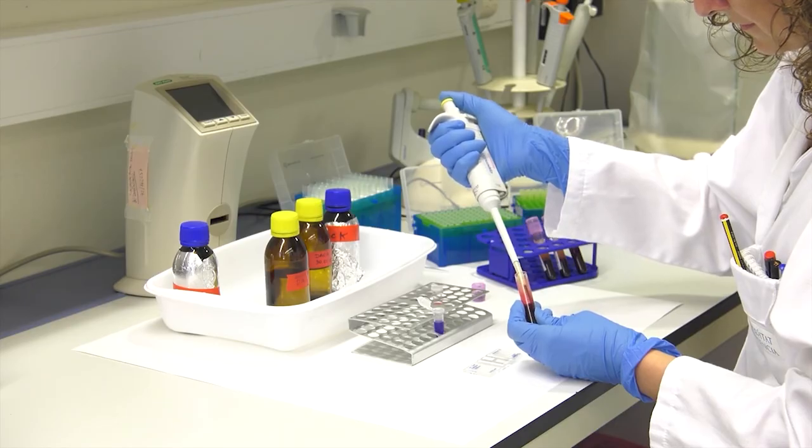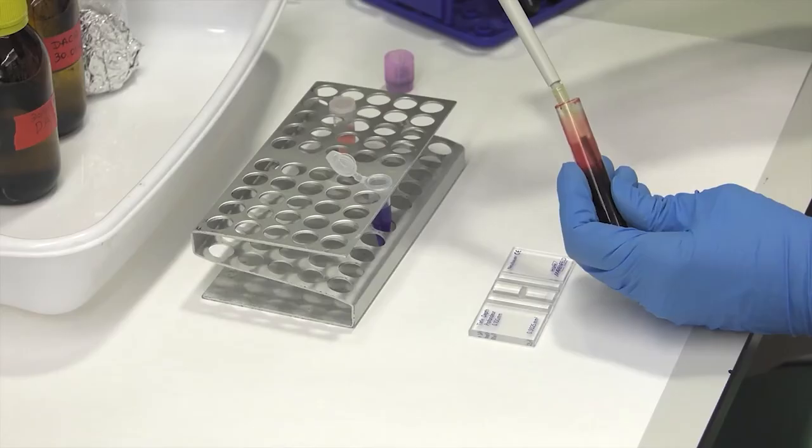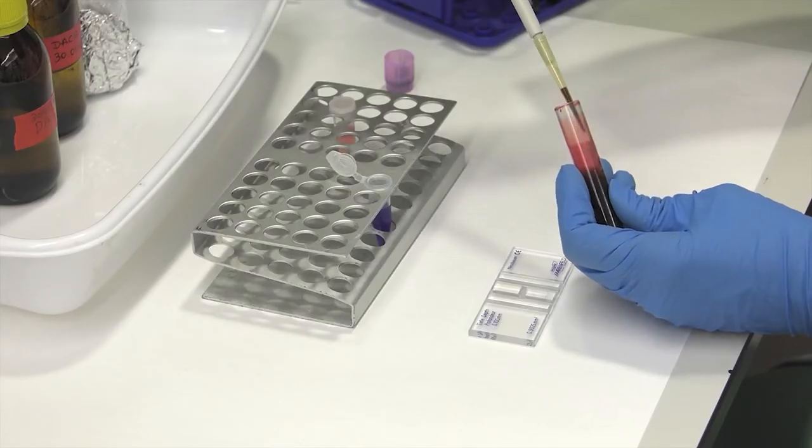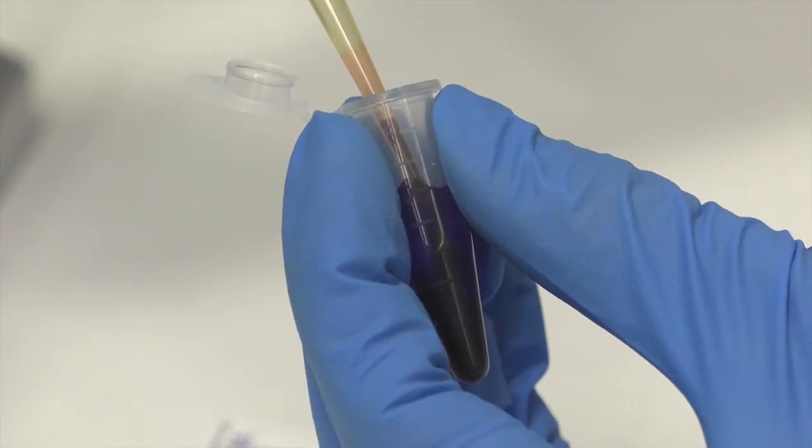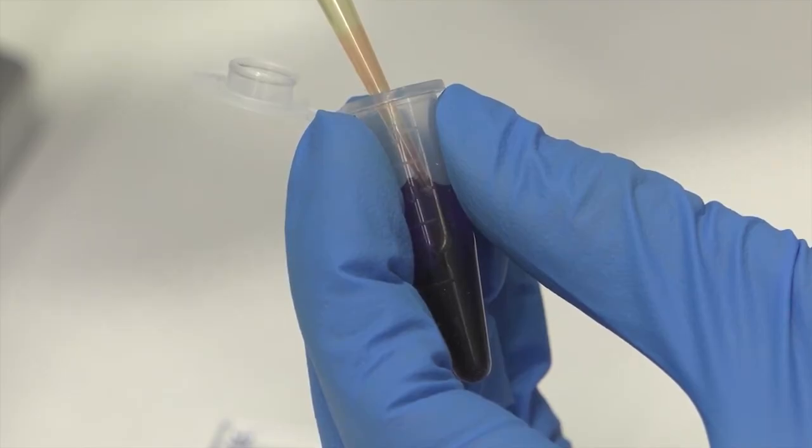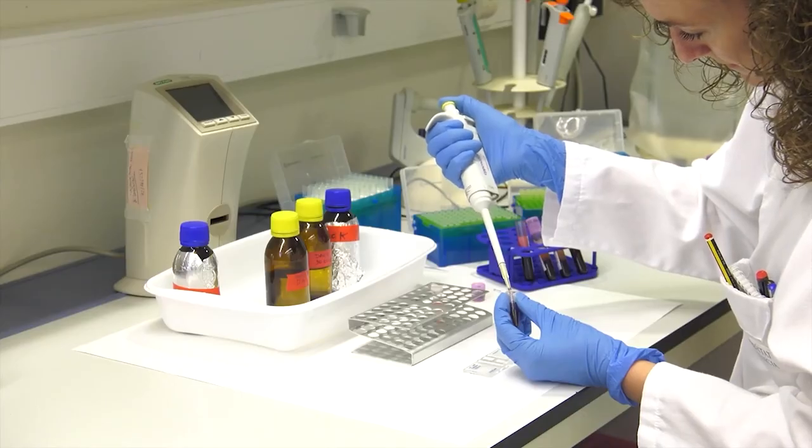The number of leukocytes in the blood is lower than the number of erythrocytes, so the dilution we use will be lower. In this case, we will make a 1 to 20 dilution by adding 950 microliters of TURK reagent and 50 microliters of blood.